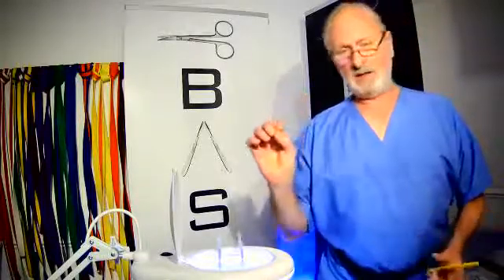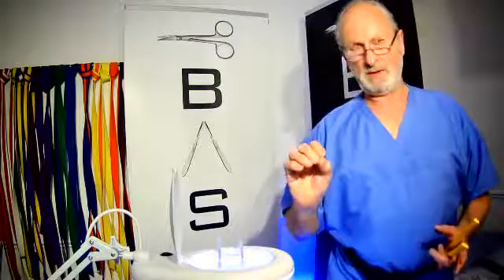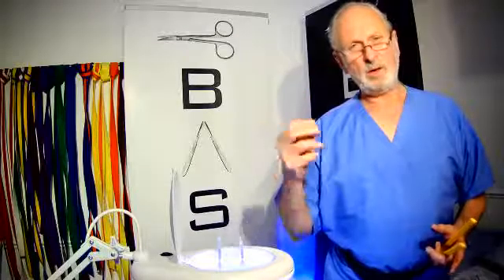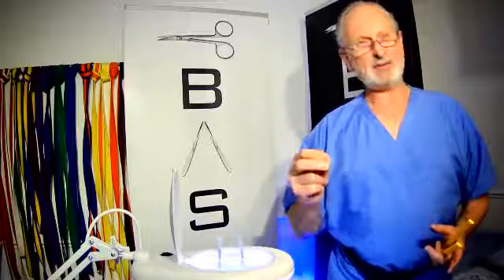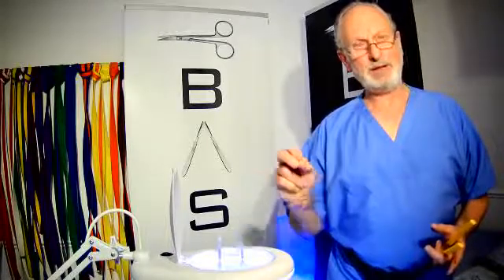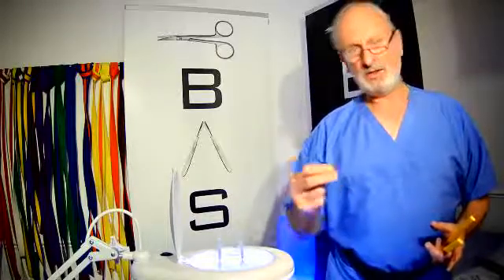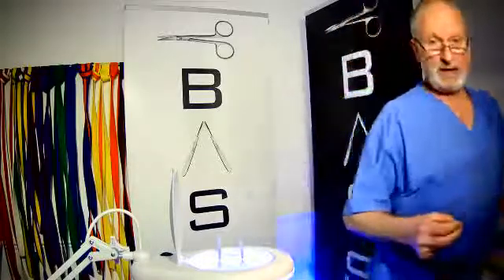The aim of this evening is to highlight to you three important elements of using the forceps. Firstly, the force that you are applying the forceps. Then, the accuracy with which you're picking things up and placing them. And thirdly, the delicacy with which you need to use your forceps. So without much ado, I'd like to take you over to the headcam and explain to you forceps.